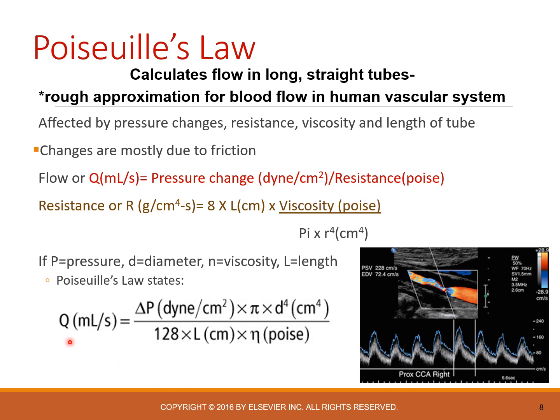Now we're very fortunate in that our computer system is doing this behind the scenes as we take our measurements. But it's important to really think about these different characteristics and how they're going to affect your flow. So if you're seeing a change in your flow, understand that a decrease in flow could be due to radius decrease, viscosity increase, or length increase. The most common of those obviously being the radius decrease when we experience a stenosis.